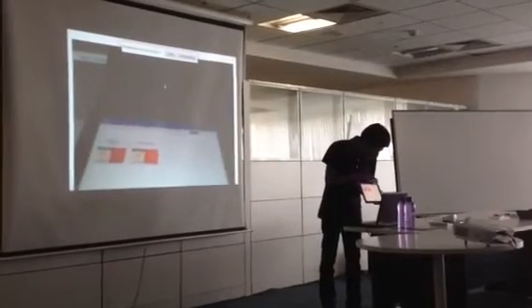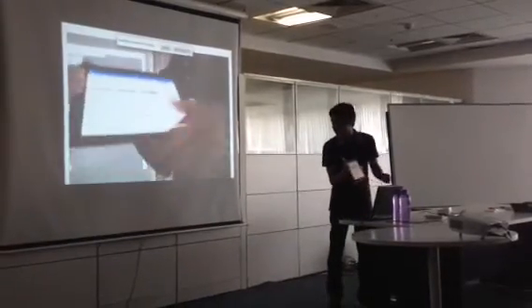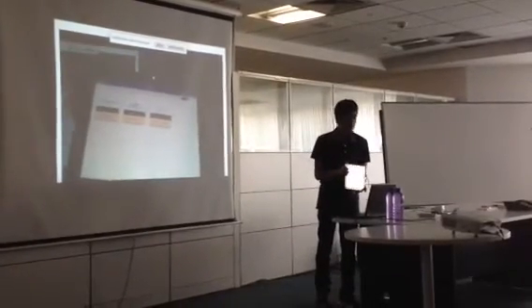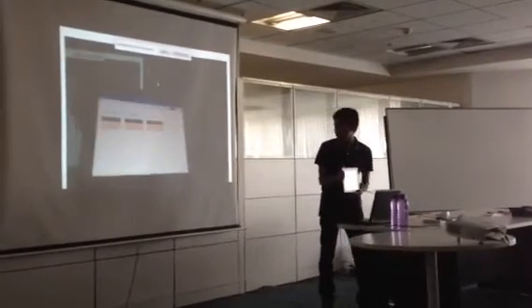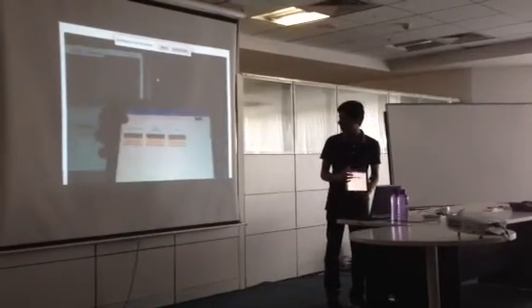This next view is in progress. It's hard to press. The in progress view shows the same thing, the patient's name. However, it shows the case status. So these are cases that have not been closed, but it's hard to read it on there. The first one says report generation in progress. As you can see, these are not clickable.